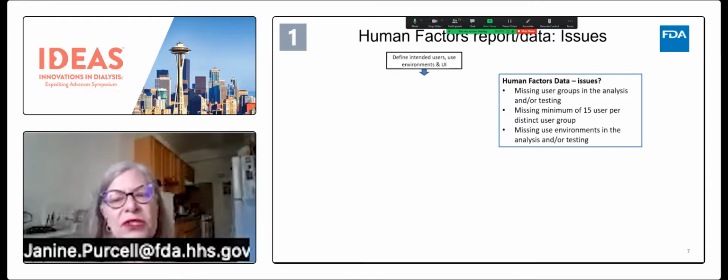And in some situations, and this is a discussion to have with the agency before you make this decision about your protocol for validation testing, is whether or not it makes sense to use an actual use study environment to do the simulated task and objective data collection, to really use a more realistic environment in a hospital for this kind of data collection.